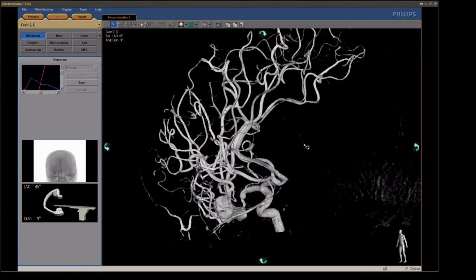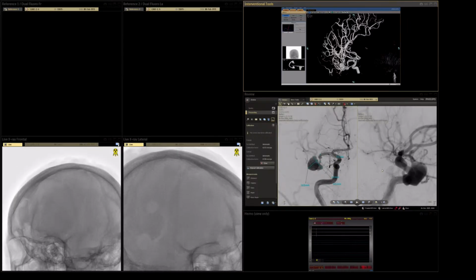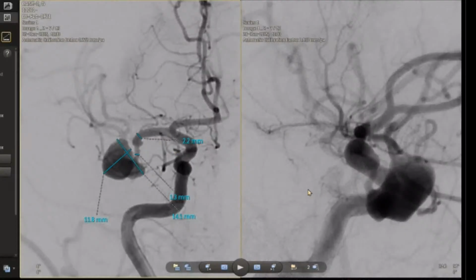It might be a stent. We can place a distal stent, and then we can coil this part, and then we may continue with the stenting in the proximal part. Or it's possible to place a proximal stent, distal stent, coil, and place one more stent in between.